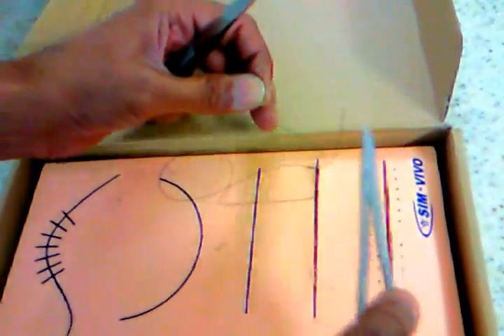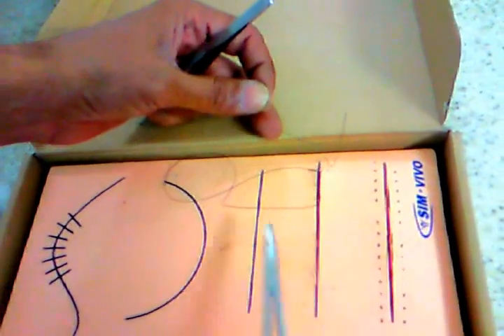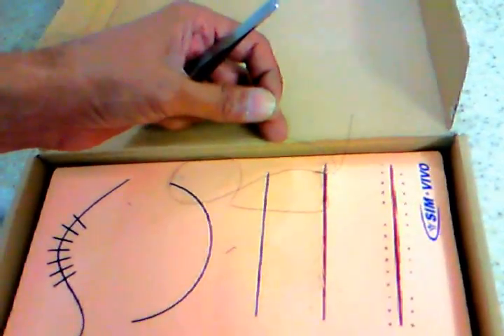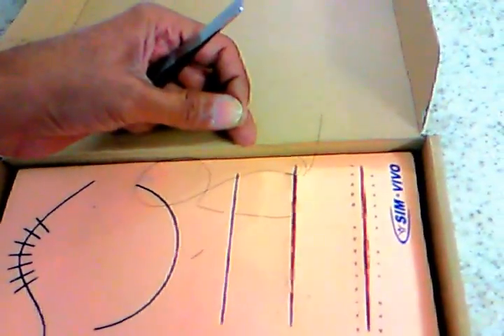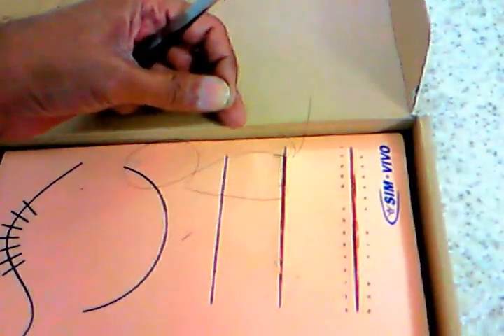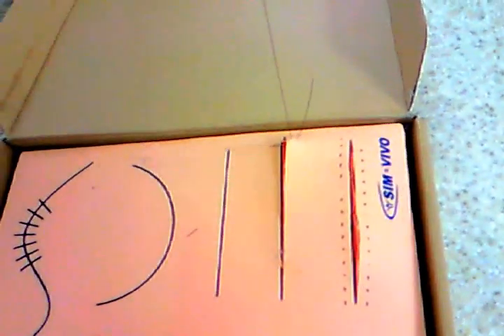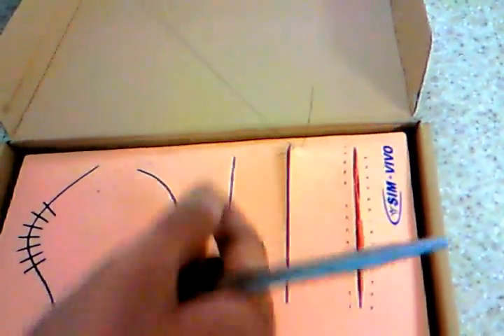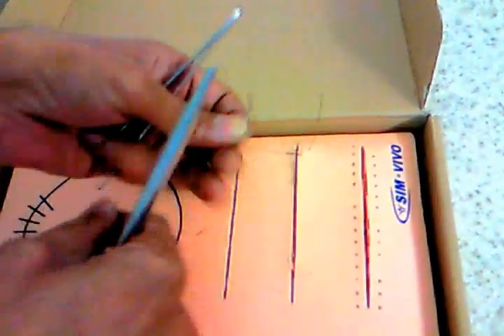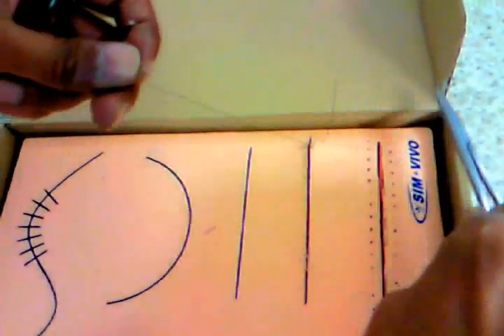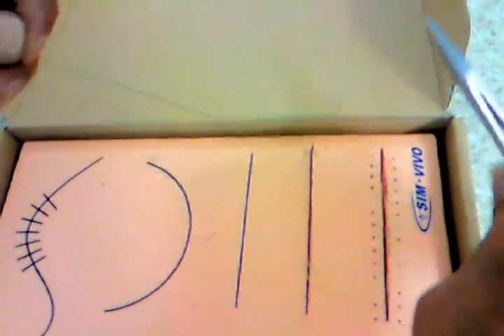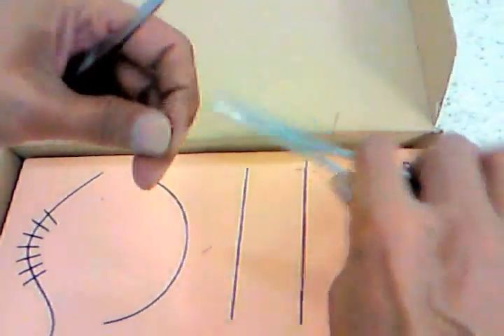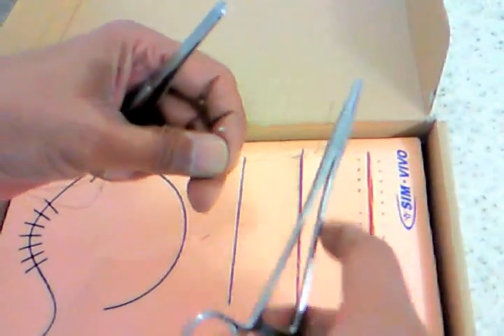So first bite was full thickness, full thickness, far, far. Second one was very close, very close, dermo-epidermal, dermo-epidermal. And when I bring it out, now what has happened is both my ends are on the same side. And now I tie it off the usual way.